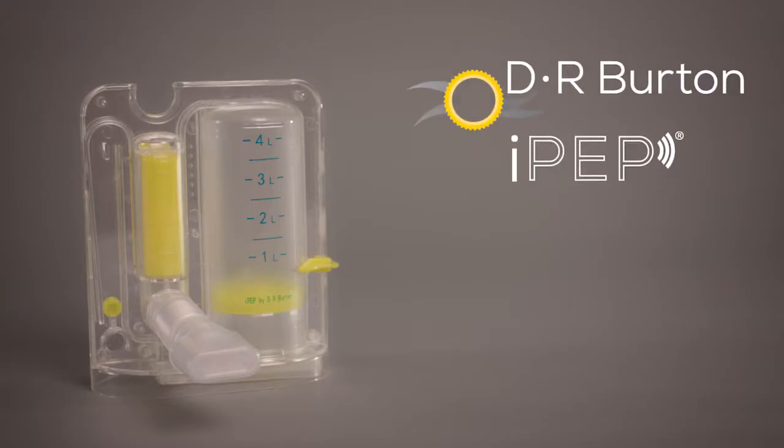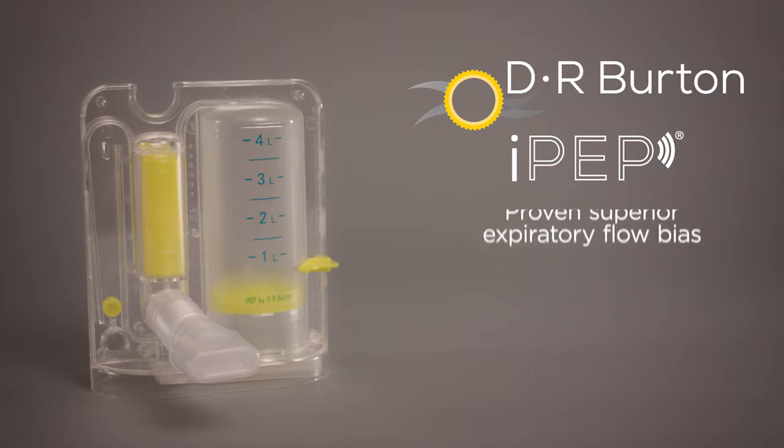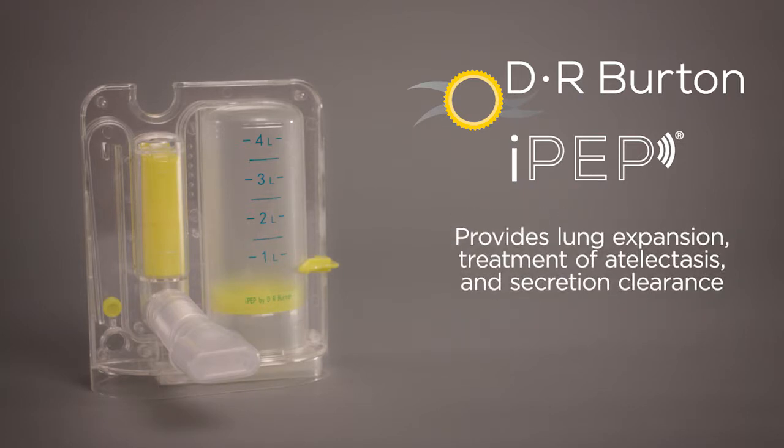The Dr. Burton IPEP system is an oscillating positive expiratory pressure, or OPEP, device which aids to loosen and remove bronchial secretions with proven superior expiratory flow bias for superior airway clearance. An all-in-one clinician tool, the IPEP provides lung expansion, treatment of atelectasis, and secretion clearance.